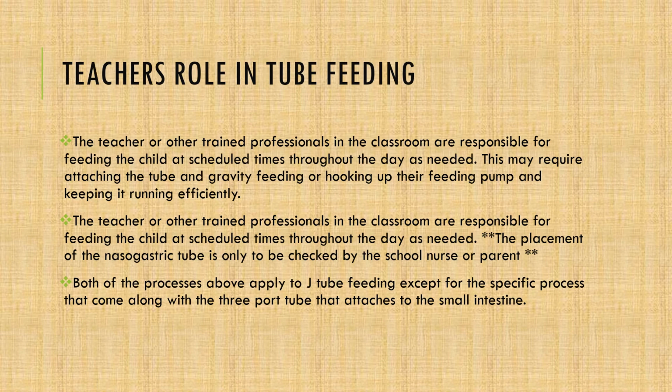The teacher or other trained paraprofessionals in the classroom are responsible for feeding the child at scheduled times throughout the day as needed. This may require attaching the tube and gravity feeding or hooking up their feeding pump and keeping it running efficiently. The teacher or other trained paraprofessionals in the classroom are responsible for this.